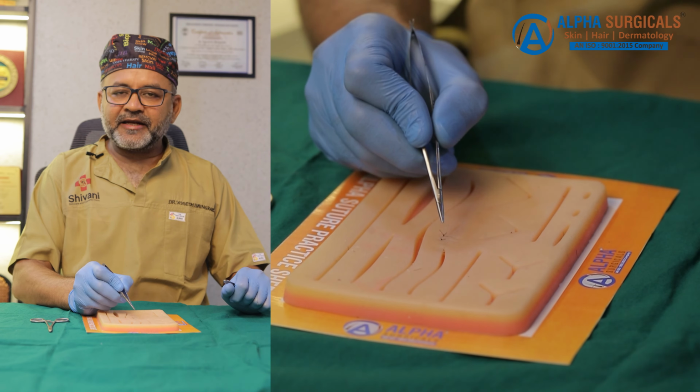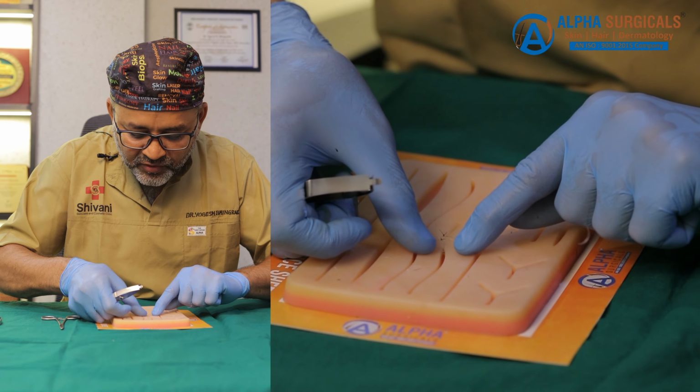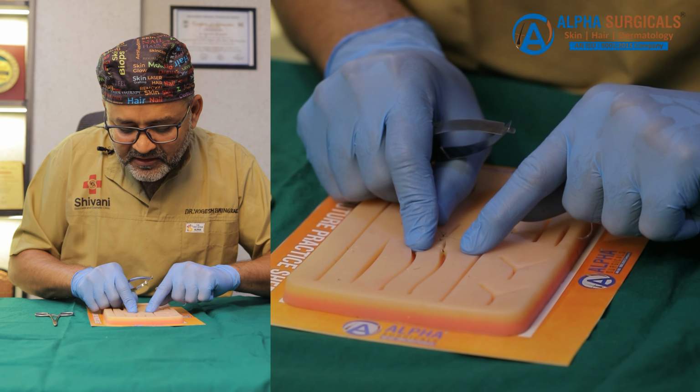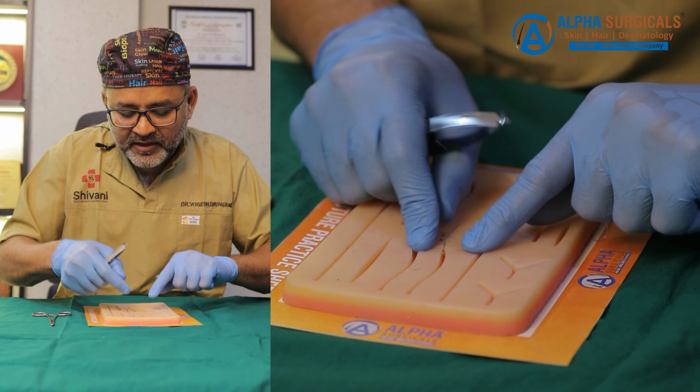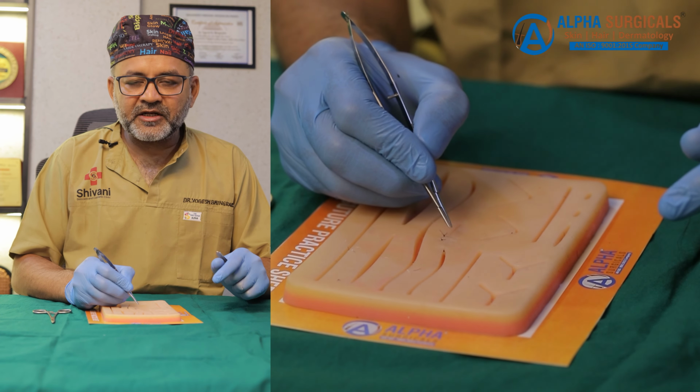So these all are the characteristics of the intradermal stitches, and if we see inside the wound, we can see the end of the suture, but the wound cavity is not there. So these all are the characteristics of your intradermal stitches.